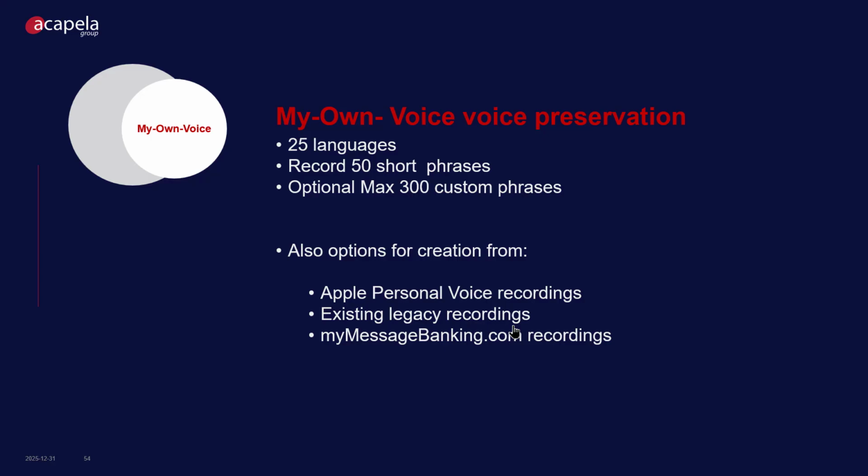Acapela My Own Voice does also have the option of creation from Apple personal voice recordings. It's often a good starting point for people who are using iOS to create their voice for free on their iPad using the Apple personal voice tool that's available there in the accessibility settings. And that does have the option of exporting your voice recordings, and it's possible through My Own Voice to create your My Own Voice 5 using the Apple personal voice recordings without having to re-record anything.